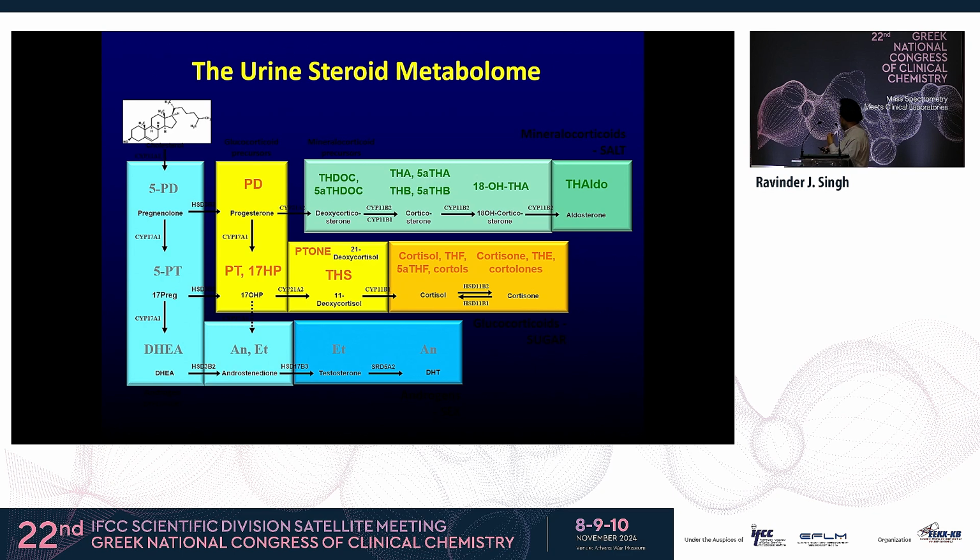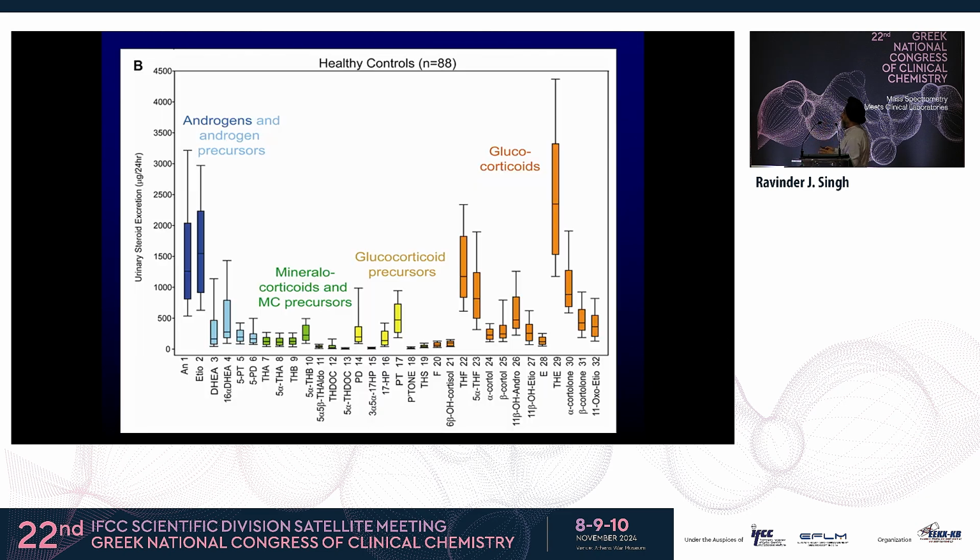Dr. Arlt's and Paul Stewart's work was not looking for the serum steroids because they didn't have that LCMS, and they went back to the old way we used to hydrolyze the urine, and this is the metabolite of 11-deoxycortisol. So tetrahydrodeoxycortisol is the metabolite, and accordingly, pregnanetriolone and pregnanediol are the metabolites. But I would not recommend anybody to use those urine steroids, especially the hydrolysis one, because they are very complicated. But because this is a rare disease, we wanted to reproduce their work, so we implemented this work.